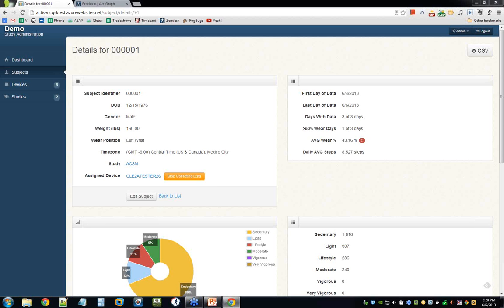But you've touched on something that is a good reason that we're doing this in the first place. A lot of times you don't know that device is broken until your lab assistant is capturing the data, and then the researcher has to screen that data and look through the information. A lot of times you don't even realize the data is not there until the study is complete and over. With this system, you know as soon as the data is uploaded if you've got a problem.